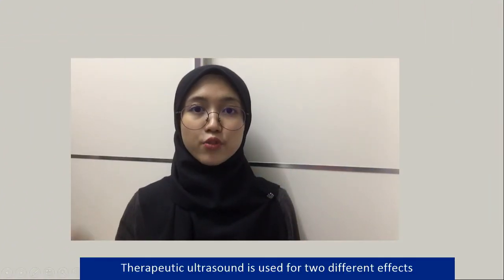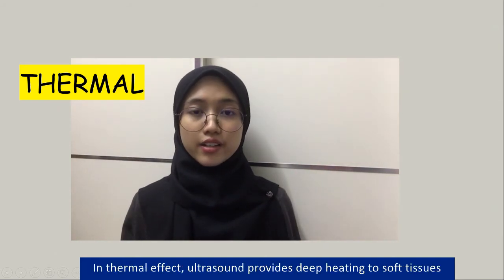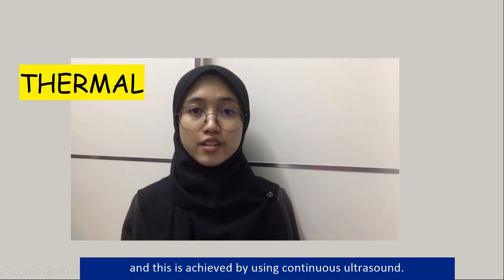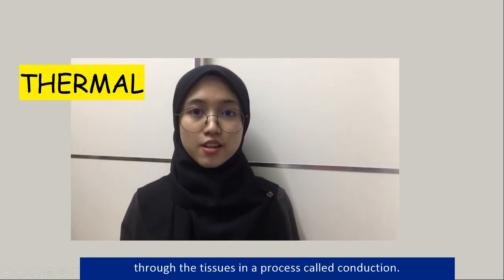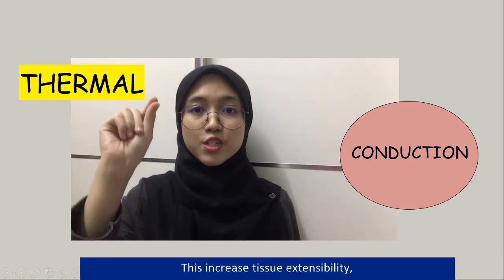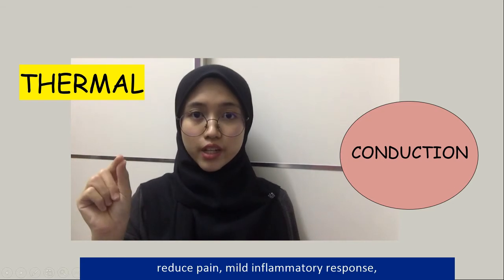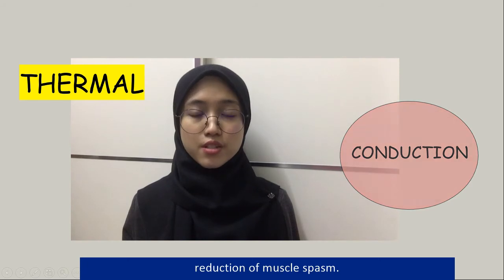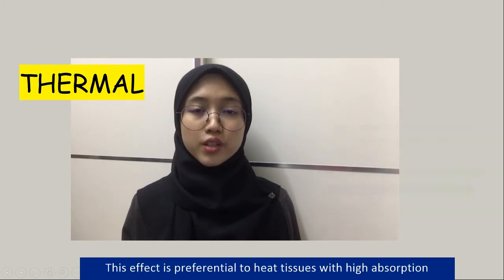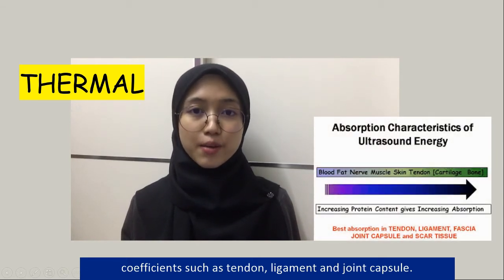Therapeutic ultrasound is used for two different effects, which are thermal and non-thermal effects. In thermal effect, ultrasound provides deep heating to soft tissues, and this is achieved by using continuous ultrasound. Heat produced from the ultrasound is slowly dispersed through the tissues in a process called conduction. This increases tissue extensibility and blood flow that aids in the healing process, reduces pain, causes a mild inflammatory response, and reduces joint stiffness and muscle spasm. This effect preferentially heats tissues with high absorption coefficients such as tendon, ligament, and joint capsule.